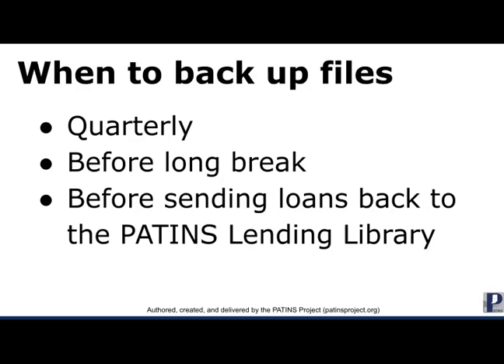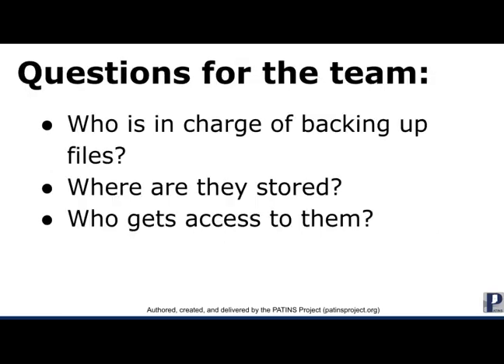If it's a student's device, this allows the student to keep their language access integrity in the event of a loss. Files should be maintained confidentially. We recommend having a conversation with the student, family, and staff about where the files are stored, who is in charge of backing up, and who has access to them.